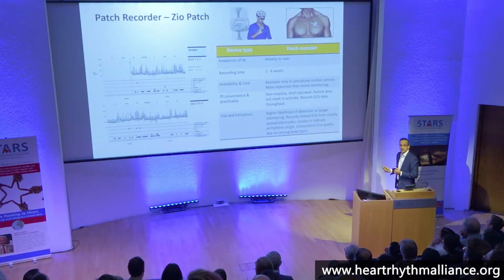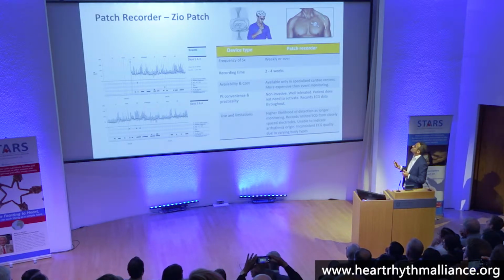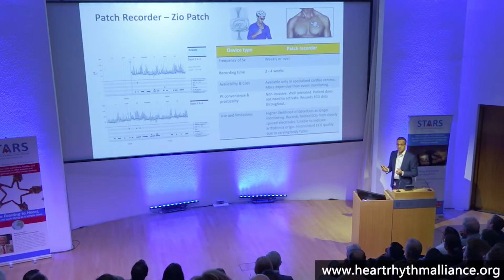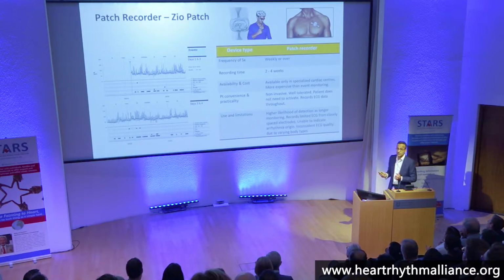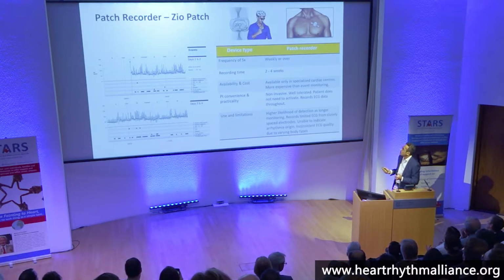This is the Zio patch. Anyone use this patch? I couldn't find a model, so thanks Nick for volunteering. This will monitor up to 4 weeks. It is not an event recorder, it's a continuous monitor. So it's very useful in patients with transient loss of consciousness. I suspect this is what you're using after the emergency department admissions, Bob? You never use them? Okay.